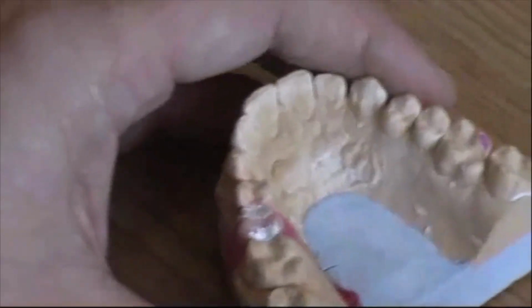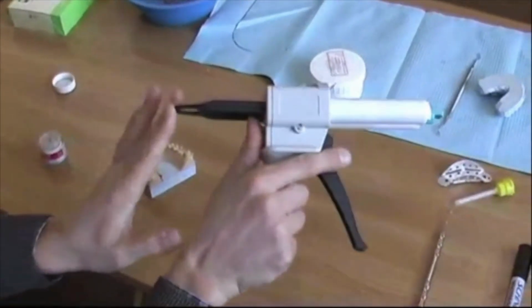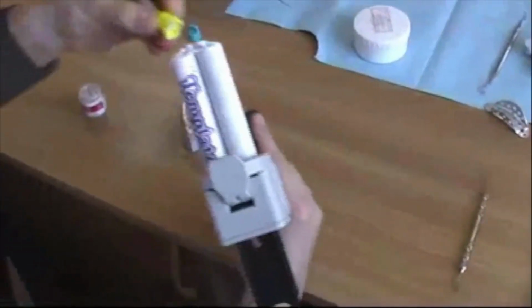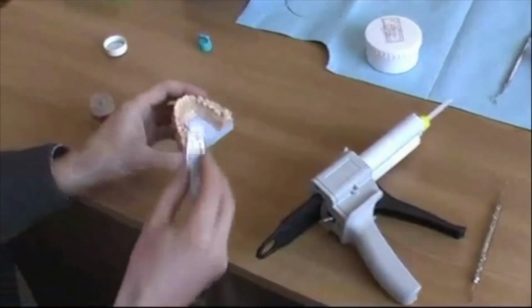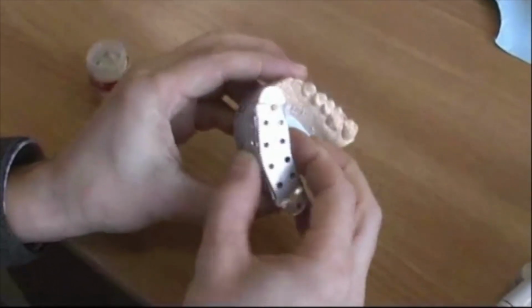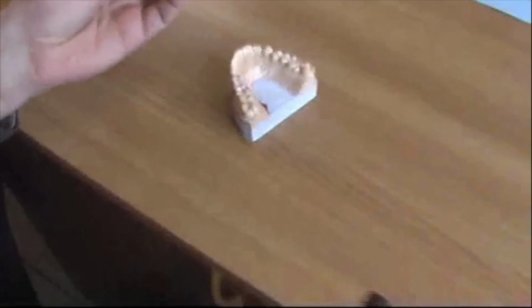So if you do it in composite, you have even better morphological results. And now this is the pistol from which you express the index material. The index material is an addition silicone in a tray. That tray is called a TEM tray. Very nice tray. It's aluminium. You can modify it if you need it wider.